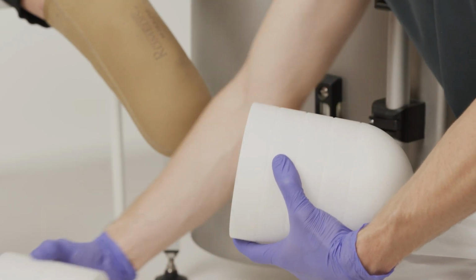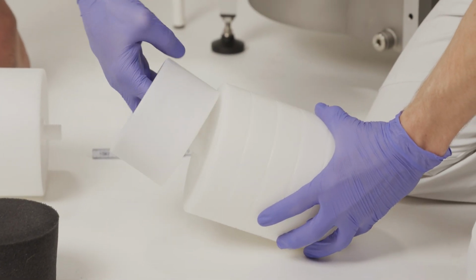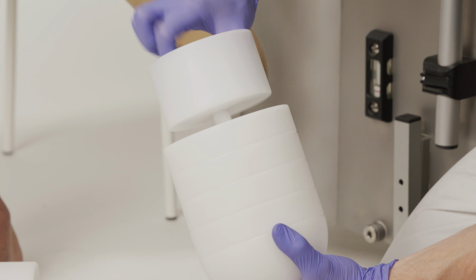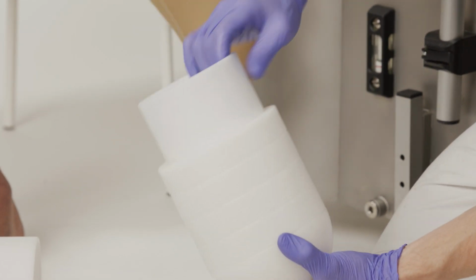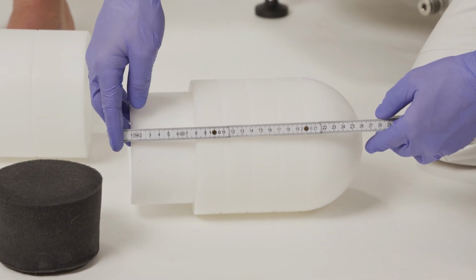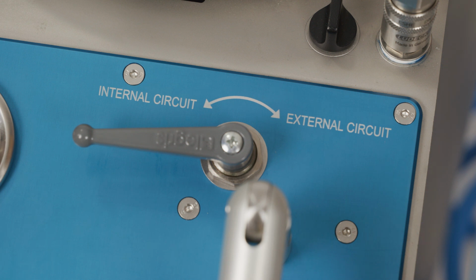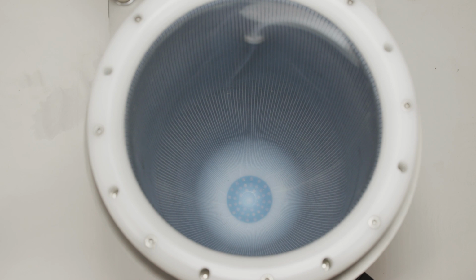The distal end cap, height compensating discs and solid cup including the foam cushion are screwed together to the calculated length and carefully placed into the empty pressure tank. Make sure the membrane is completely open before placing the vector tower in the pressure tank.